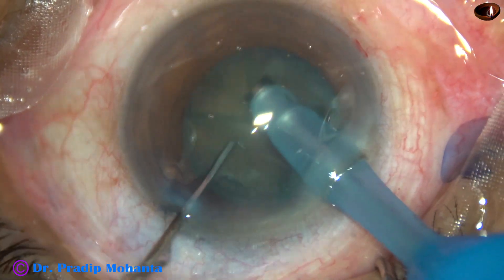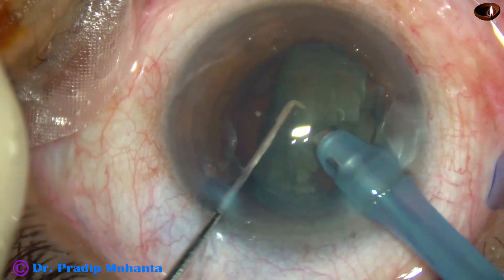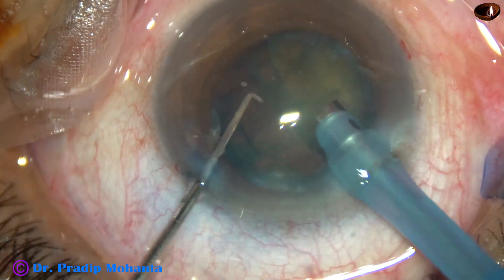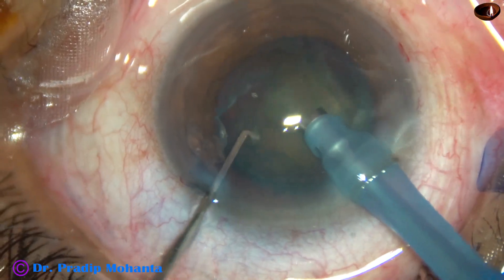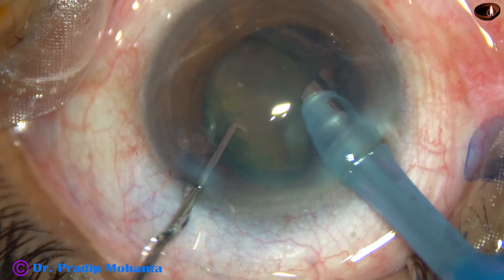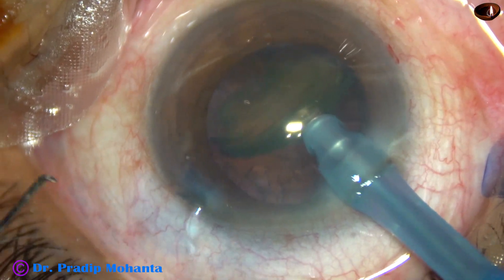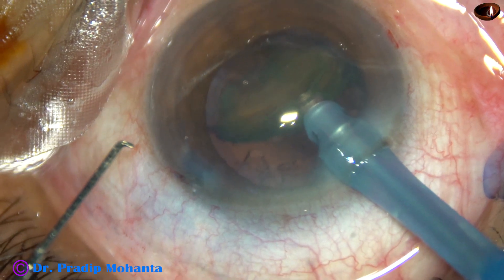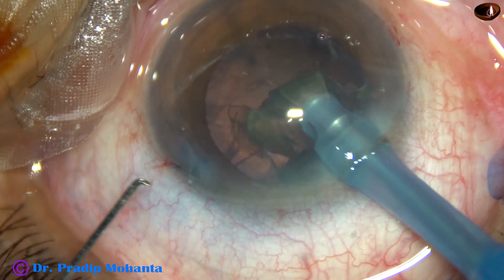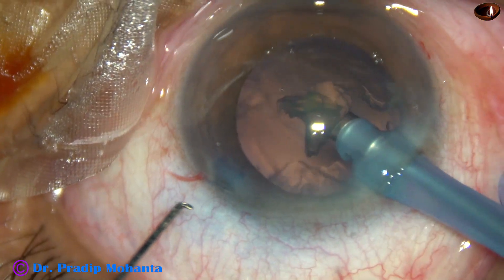See how easy management of the nucleus is because of the large rhexis. The whole nuclear mass tilts and comes to the tip of the phaco needle. During emulsification of the last piece, we have to be extra careful. At this time, I ask my assistants to reduce the vacuum — so far it was 400, now it is only 200. The flow rate is also reduced, and the last piece of nucleus is managed.